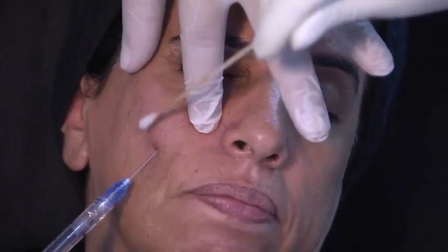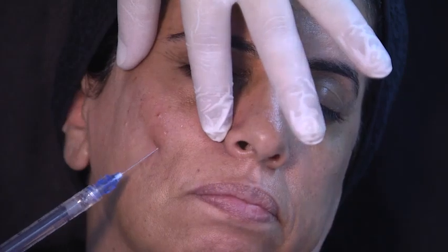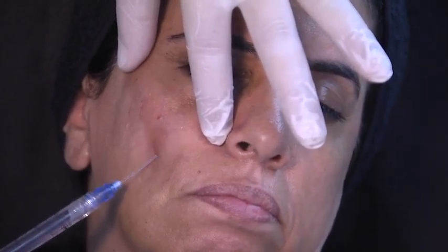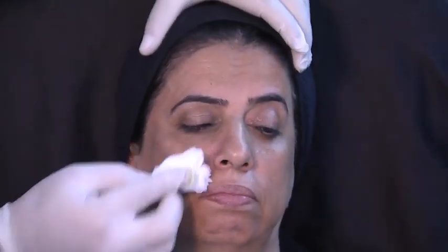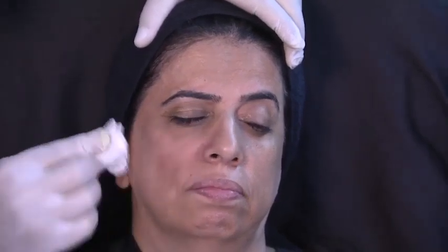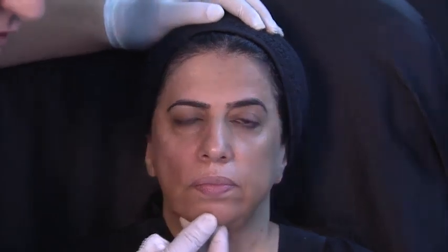But this product has a bigger particle size. In a few days, it will retain more water, and the particles are bigger, so it gives me bigger volume in this area. Remember, in this case, we're putting everything together, combining the treatments. Now I'm doing my fan technique. I'm actually here, and I finish my milliliter. And this is what I want to show you now: when I finish my milliliter, there is always place for a little bit more.